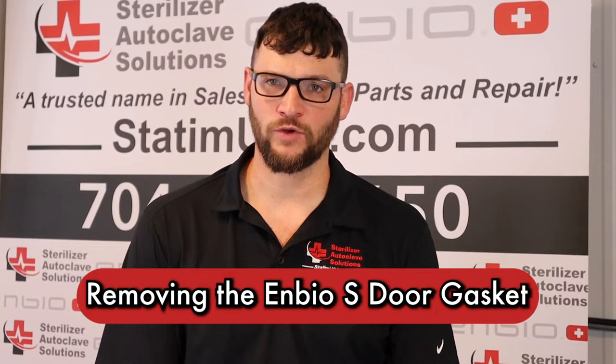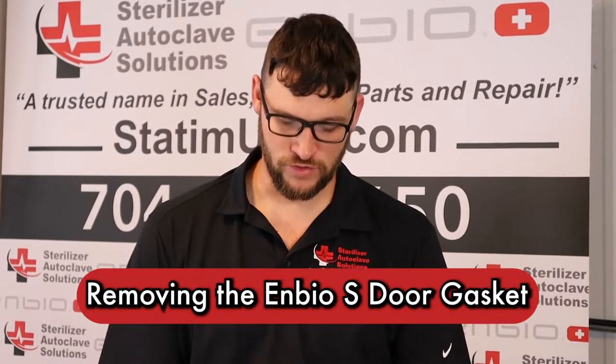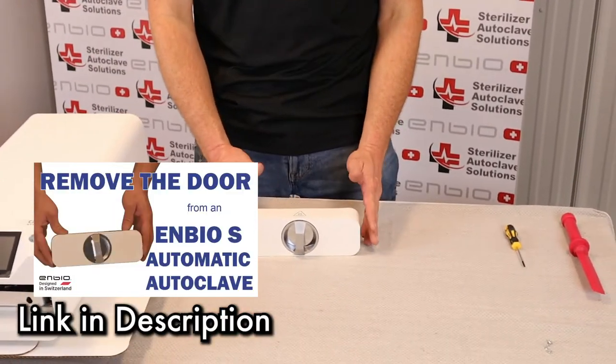Hi, this is Ian with Sterilizer Autoclave Solutions, your United States Warranty and Service Authorized Repair for the NBOS. Today we are going to be removing the door gasket from the door. The door was removed in a previous YouTube video.